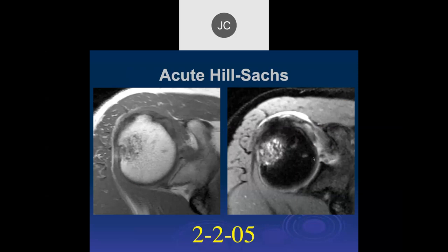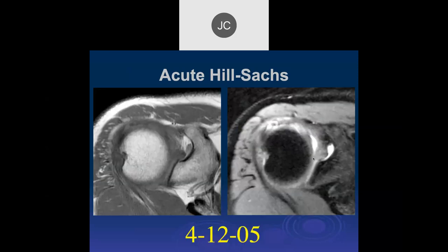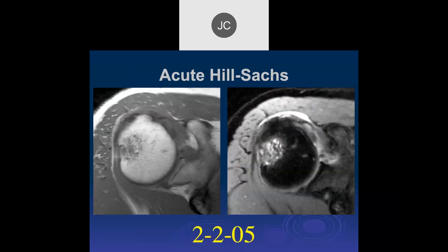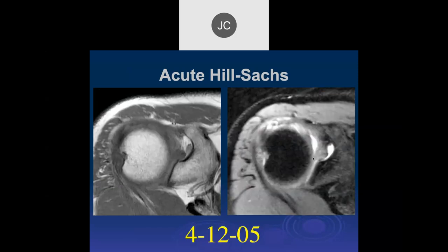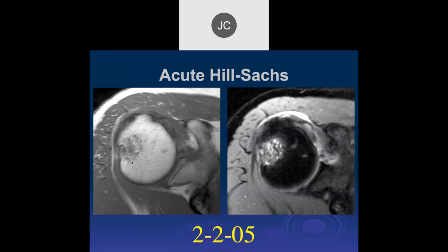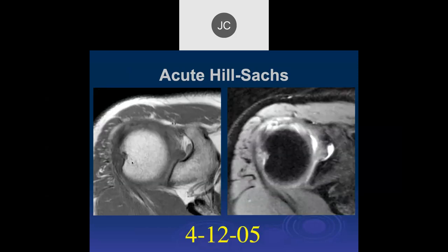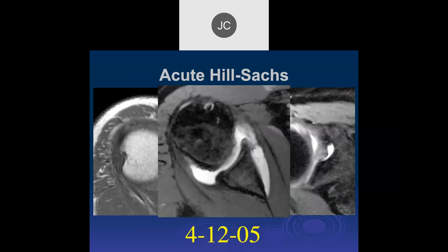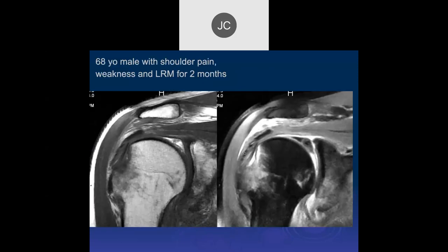An acute Hill-Sachs shows edema in the superior posterior aspect. Two months later there's reduced edema within the humeral head — there's still a cortical defect, that V-shaped configuration. In the acute stage there's acute edema, and within weeks it resolves. A little blunting of the anterior labrum with increased signal intensity but no discrete displaced tear visible at two months.